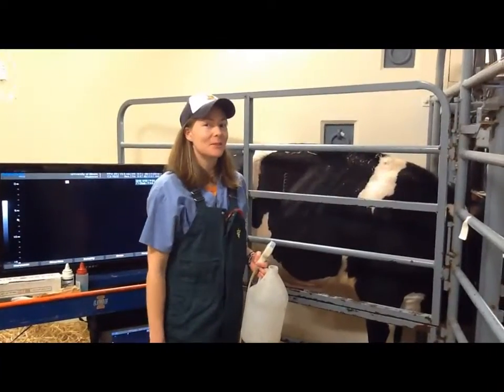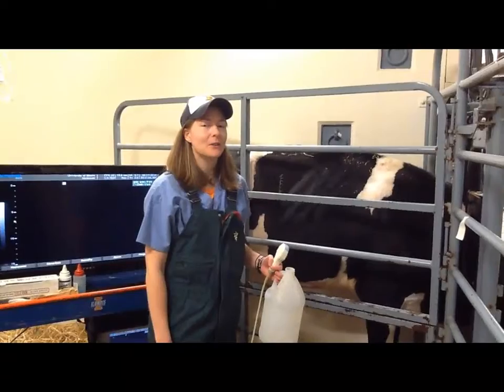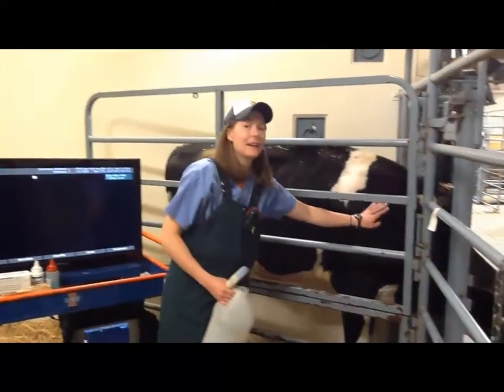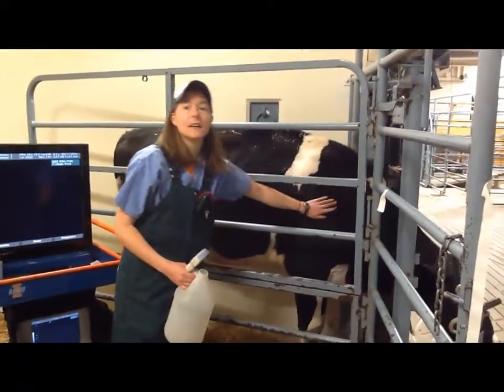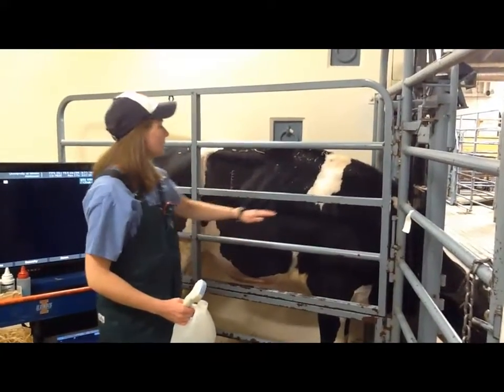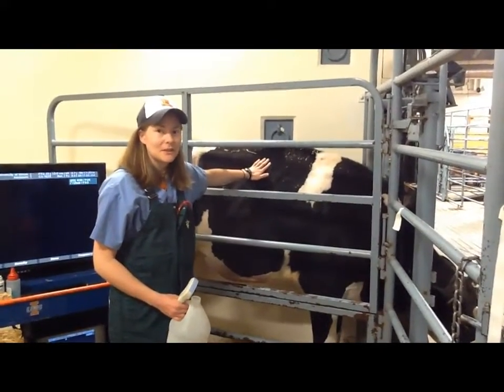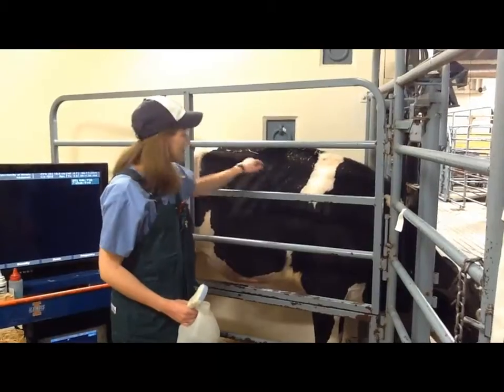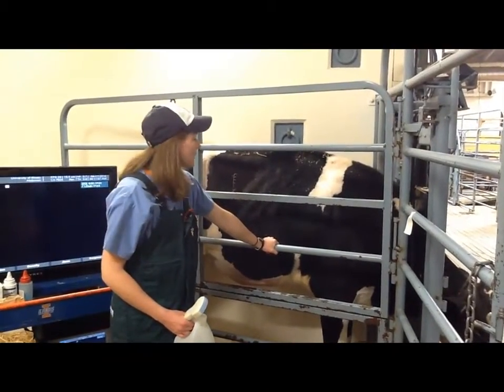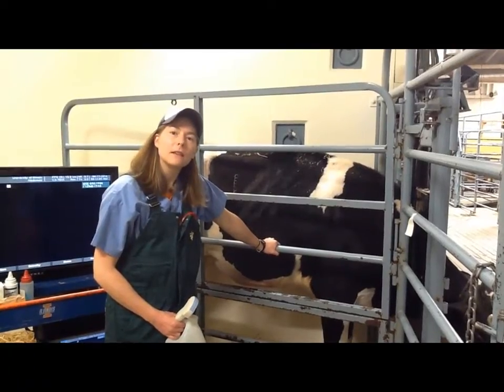Hello, we're here at the University of Illinois, and I'm going to show you how to do an ultrasound on a cow to diagnose respiratory disease. So why do we use ultrasound to diagnose respiratory disease? It's a very quick and easy way. There are lots of ways to diagnose respiratory disease, but this is probably the easiest.